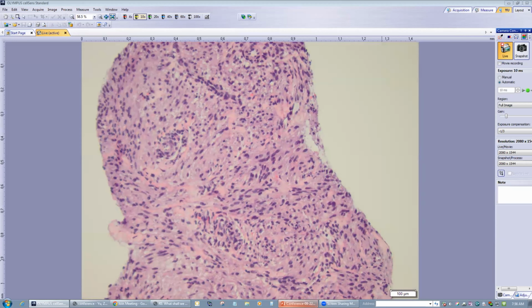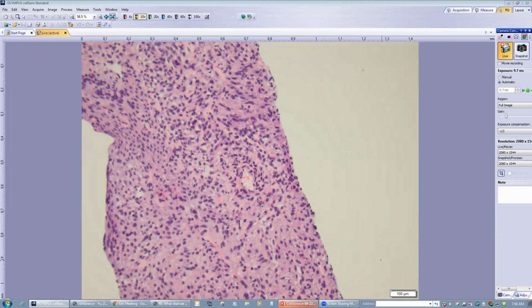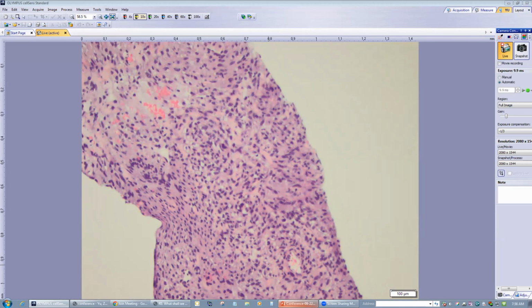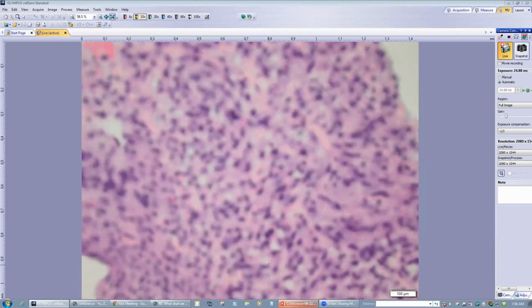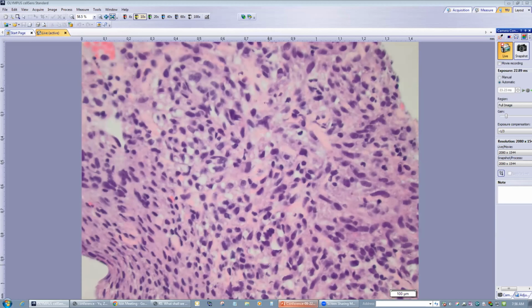So when we received the biopsy this time, there was another vessel, very closely associated with the thick wall vessel. At that time, we got the clinical workup: the patient had a brain tumor, I don't remember the exact diagnosis, but anyway, clinically it is called tuberous sclerosis. So with that information, with this morphology, spindle cells with an angio component, we did the HMB45, and it is positive.